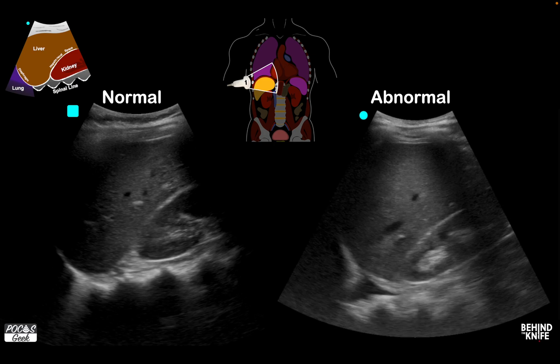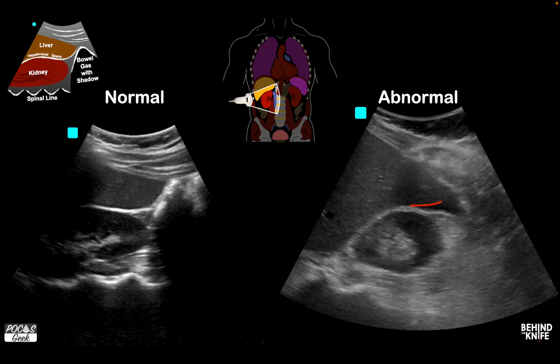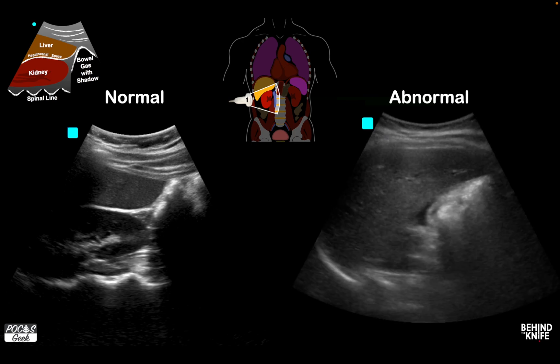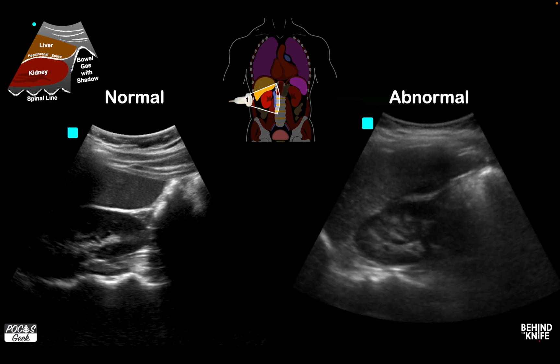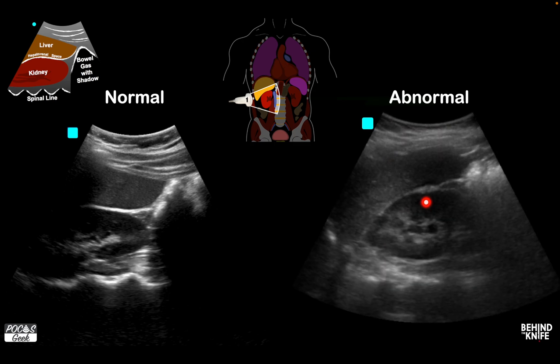In a patient, we can also identify very large amounts of hemorrhage, which can indicate the therapies that need to take place. In this view, we're going to start paying attention to the hepatorenal space between the liver and the kidney, looking for fluid. This can be quite subtle — just a sliver of fluid — so it's important that we do this dynamic exam and evaluate the entire space. The inferior tip of the liver is the most sensitive area in the right upper quadrant; this is where fluid collects first, often referred to as the paracolic gutter, and from there it will dissect up through the hepatorenal space. Small amounts of fluid can be quite difficult to detect, so we want to fan through this area extensively to identify any anechoic structure.